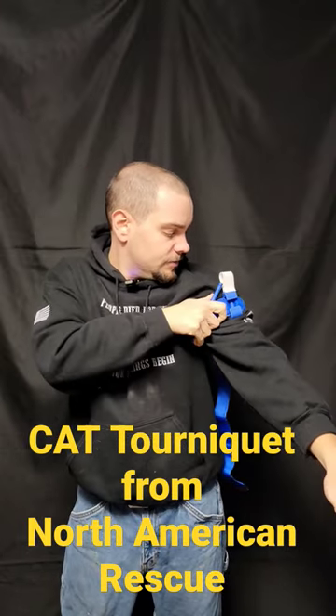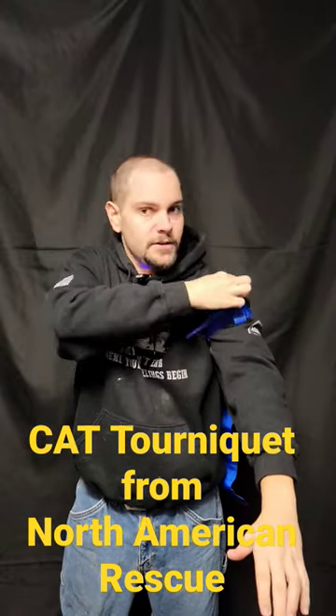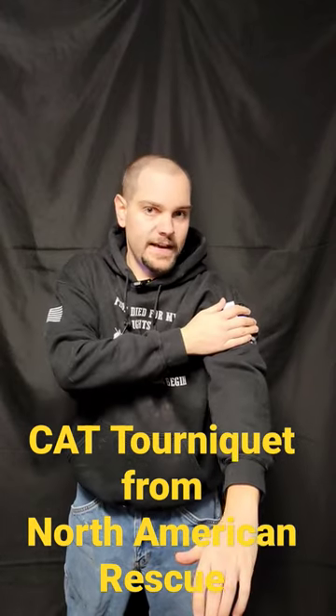Wrap your windlass as tight as you can go until the bleeding stops. Once the bleeding stops, secure the time stamp over it, right at the time the tourniquet was applied, and then move on. That's how you apply a CAT tourniquet.